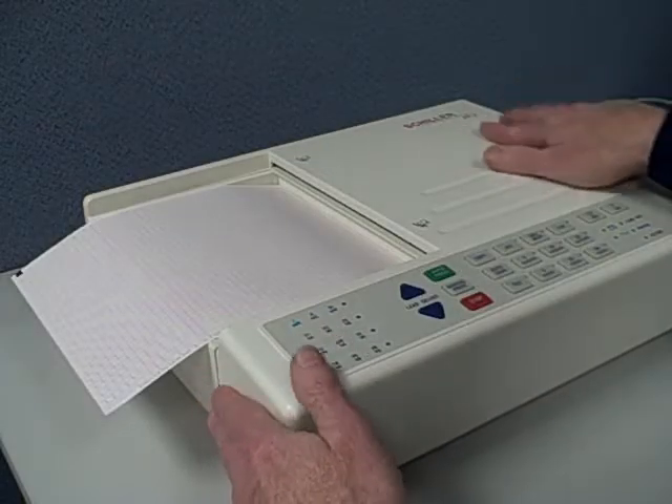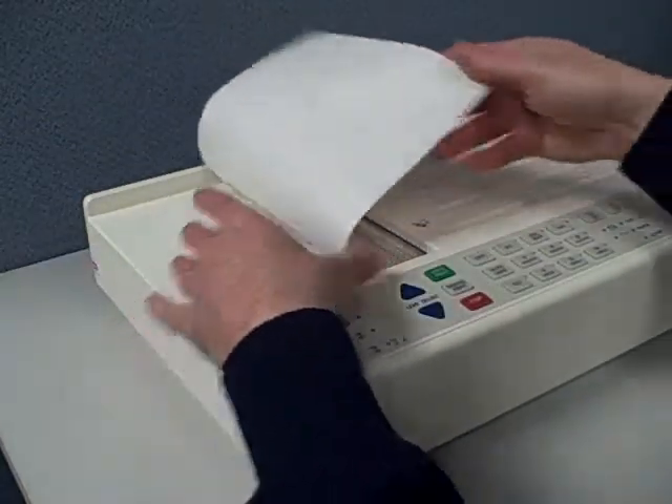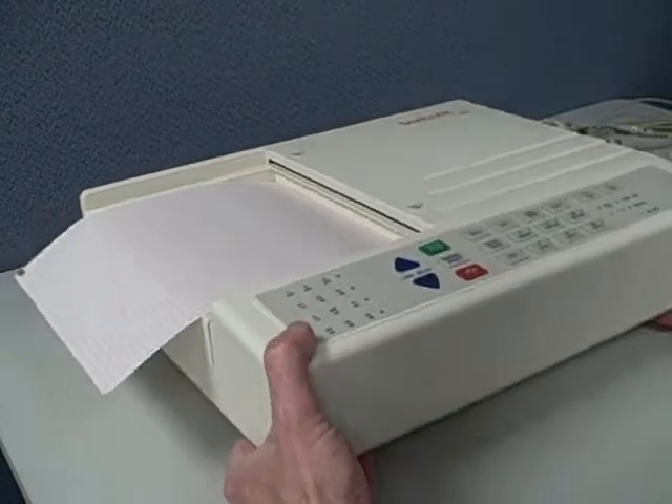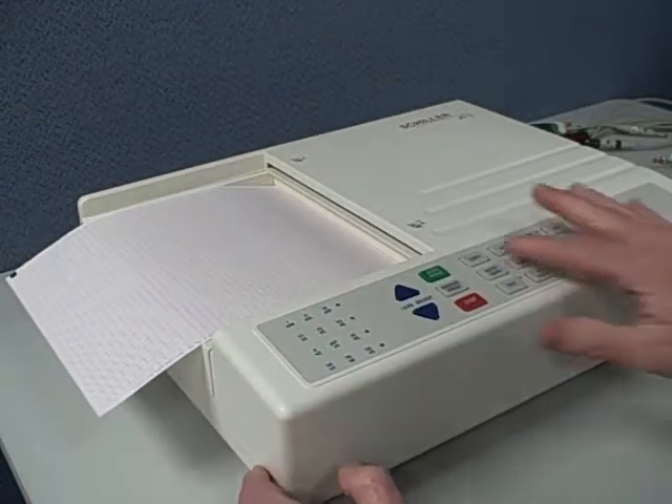Hi, this is Walt and today we're looking at the Schiller AT2 EKG machine. It comes in either interpretive or non-interpretive versions. It weighs about 12 pounds, kind of in the middle of the pack in that regard.